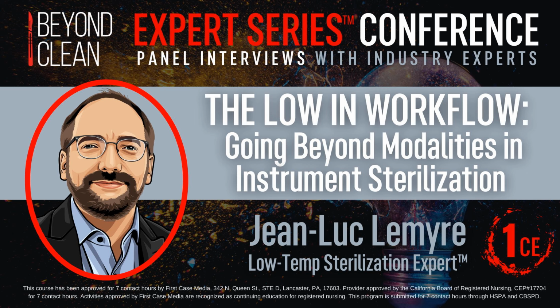Yeah, so ozone specifically in our system, which I think is the only one that has it in the cycle, is used paired with peroxide. Peroxide does a lot of the workhorse sterilization, and ozone does two things: an additional lethality, basically making the cycle more efficient to sterilize in long lumens especially. And it also helps with the reduction of residual peroxide on the device. As we've discussed with biocompatibility, we want to control peroxide on the device at the end of the cycle, so ozone helps with that. And ozone going through the same catalyst is transformed into pure oxygen, O2, which is safe for the user and environment.